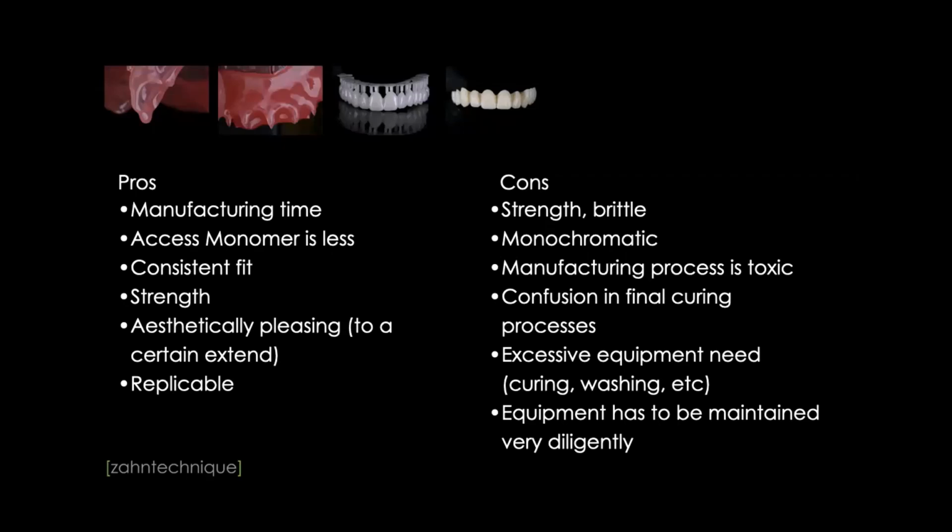Then there's a lot of confusion in the final curing process. I think that's a very big con, because we have to understand how to actually finally cure these specific resins. Almost every resin needs a different process to cure, just in time. We have different time differences in the curing process, but also some of them need nitrogen, a gas, to cure. Some of them need glycerin to cure, or different curing chambers. So that's the difference. It's sometimes really confusing.